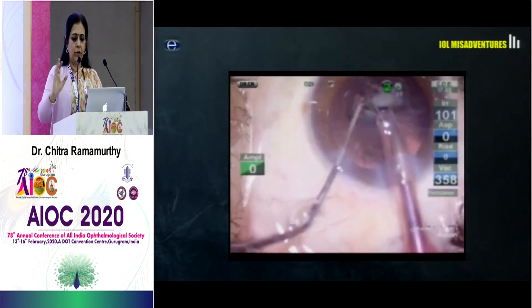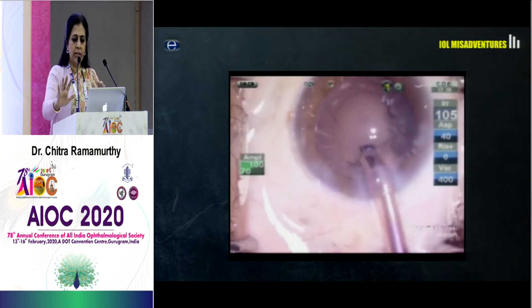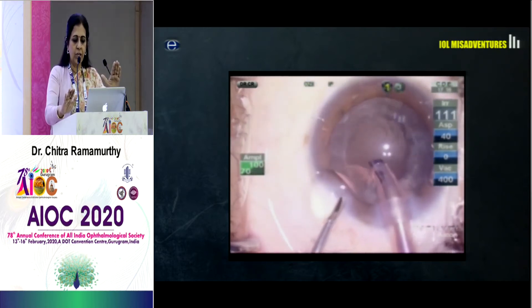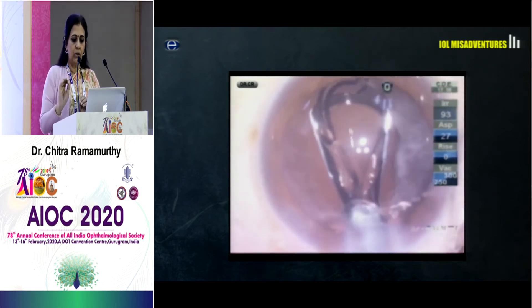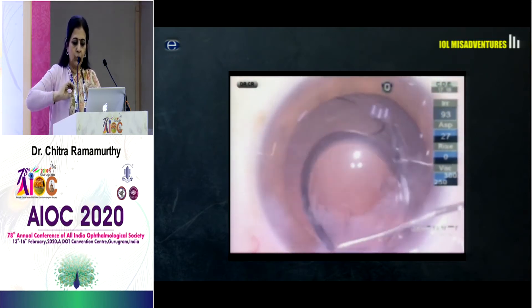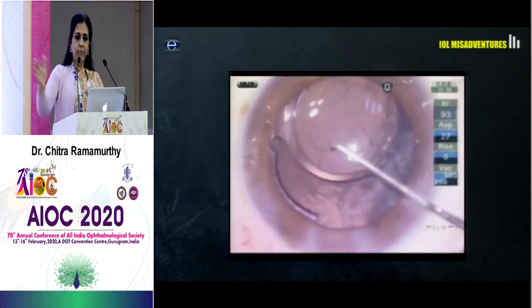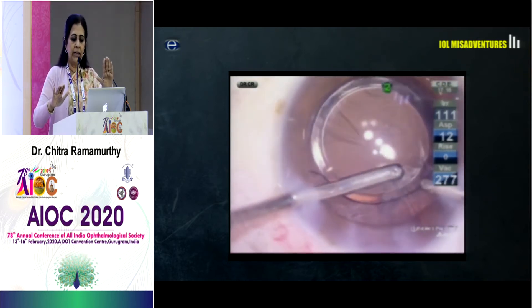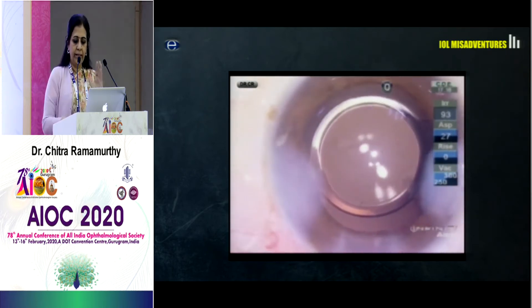A very simple case — phacoemulsification is nearly done and there is a small drip of PCR you can see. I keep my phaco probe in; I don't want the AC to shallow and vitreous to come forward. I go in through my side port and inject viscoelastic to push back any vitreous. Then I inject a single-piece IOL very gently into the bag. Stretching of the haptics should not be allowed; rotation of the IOL should not be allowed. With the IOL sitting right where it is, gently tuck in the haptics. The IOL here is acting like a scaffold, keeping the vitreous behind and preventing herniation. With absolute comfort and ease, I remove all the cortex and have a clean case.